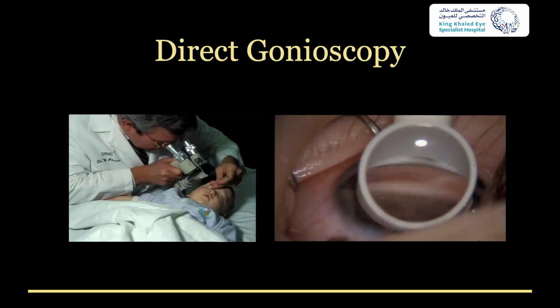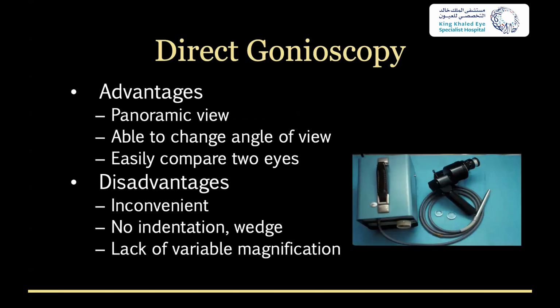This is me doing direct gonioscopy on a baby with the Swan-Jacob lens. Obviously, the baby's sedated. So there are some advantages. You get a panoramic view. You're easily able to change the angle of view.